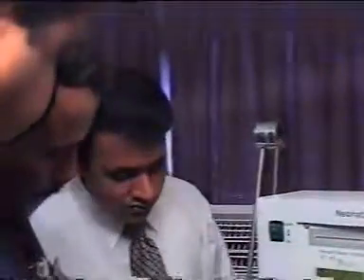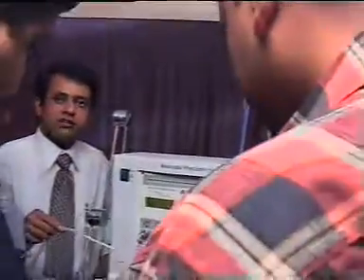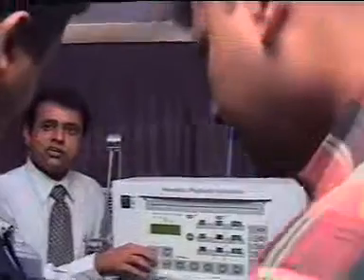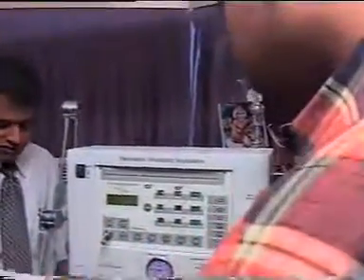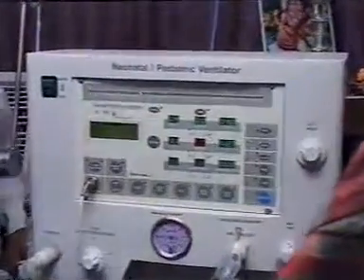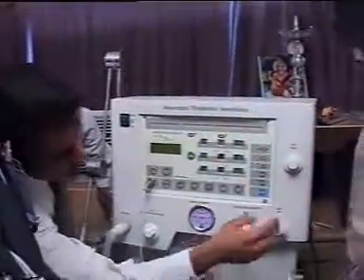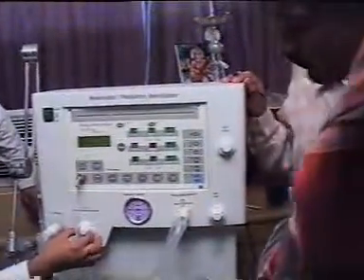From there it comes into the expiration line, from the patient. And this is what is known as the pressure manometer line. So these are all what you have. And you remember I told you about that intelligent device? This is the flow sensor. And where is the flow sensor attached? Just near the patient. Why near the patient? So minimal deflection is picked up by the ventilator, and hence this is an advanced ventilator. So let's pick up. This is the set pressure, this is the pressure sensor. This is the FiO2 knob.